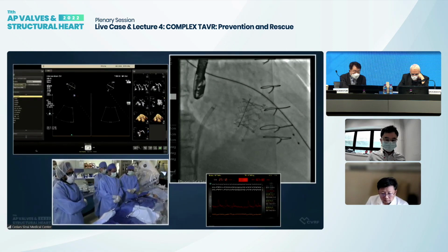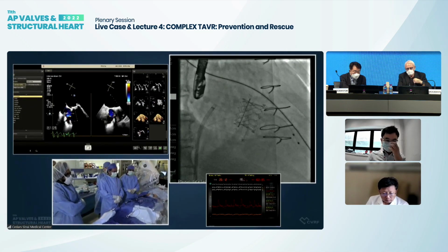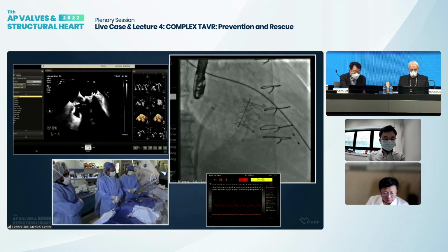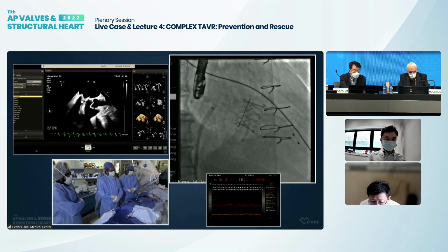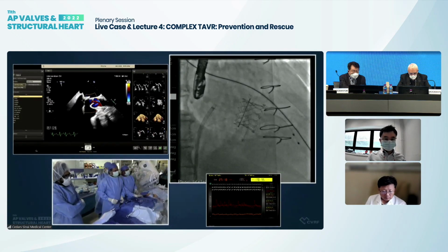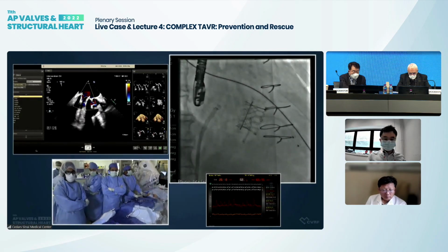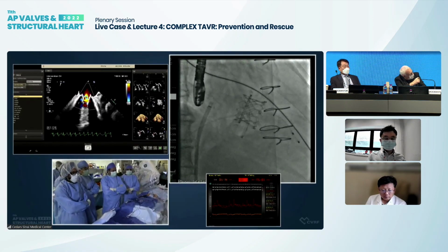Okay, so I think there's at least a little tachycardia here. The STs have normalized. The STs are normalizing now. Yeah, you saw that. All right, so do you have any other questions or comments? We are told we have only 3 minutes left. Paul?